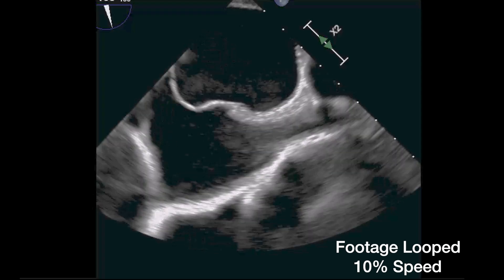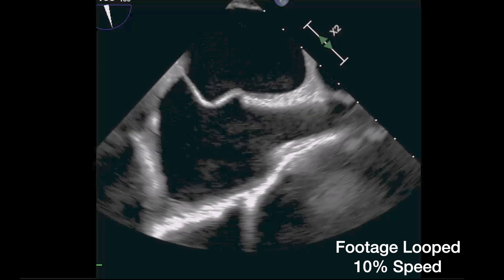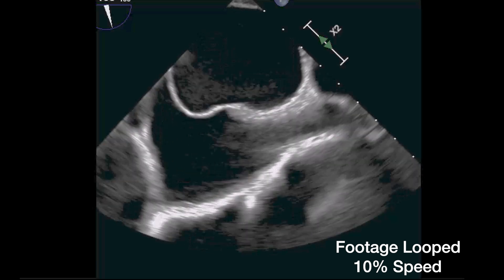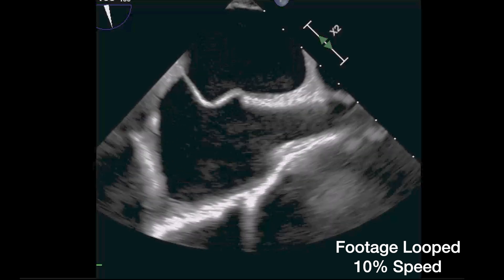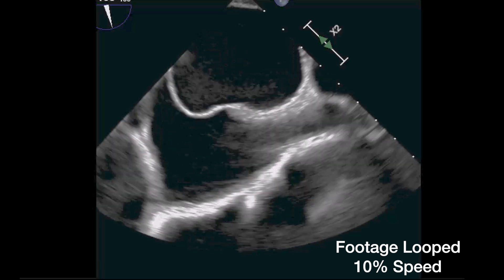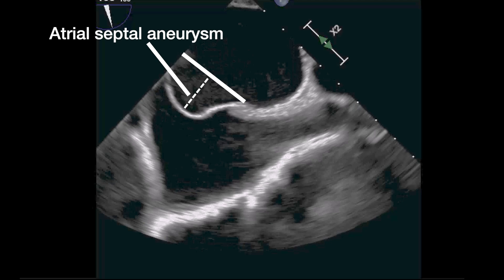This particular patient has a high-risk PFO, given its large shunt size and a concomitant atrial septal aneurysm. A concomitant atrial septal aneurysm is defined as 10 millimeters or more of excursion of the septal wall from midline.